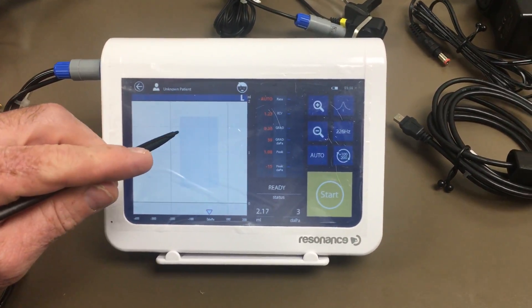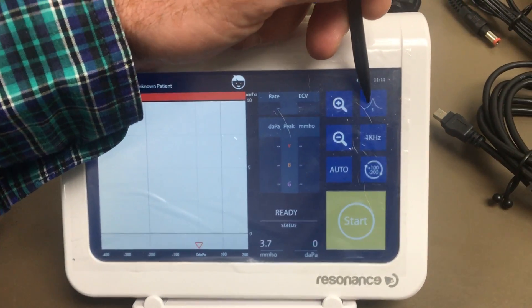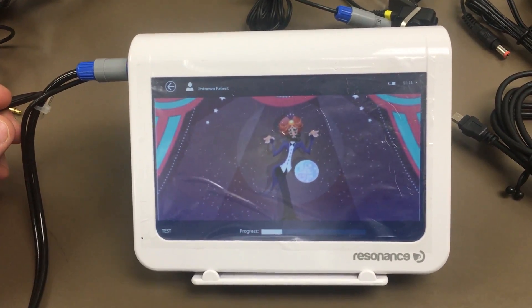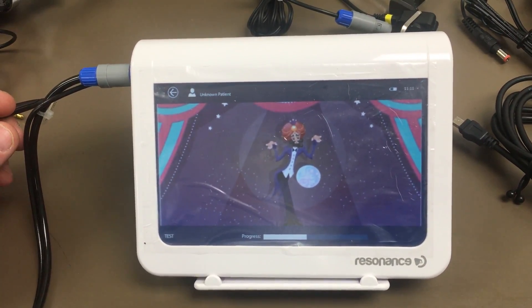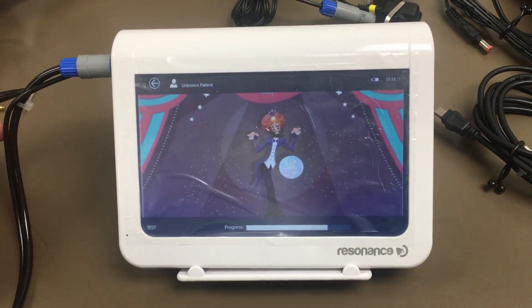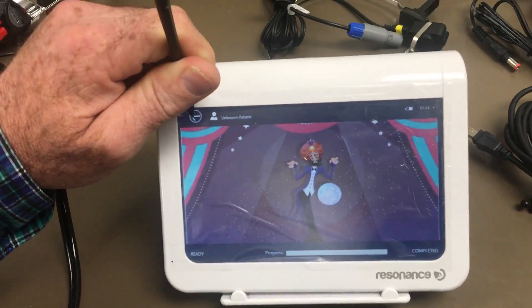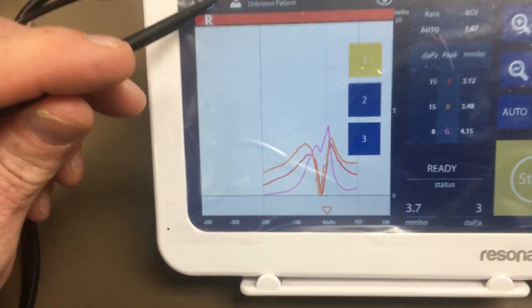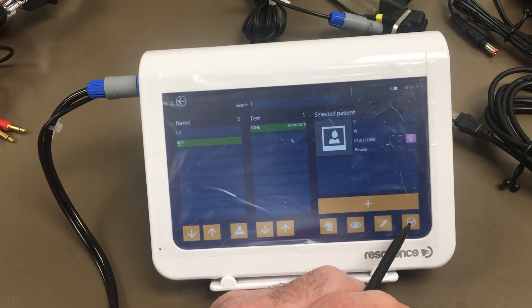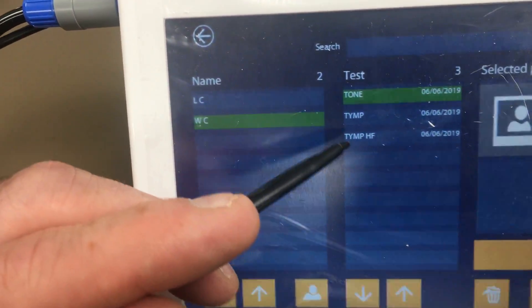To do the other ear, just switch left or right. If you want to do multi-frequency tympanometry, you can switch it to 1000 Hz and do three frequencies. When you back out, you can see all three tests listed. It will ask you if you want to save — select yes, click the arrow and the checkbox to assign it to the patient. When you go back in, you can see where you did the standard tympanometry and the high-frequency tympanometry.